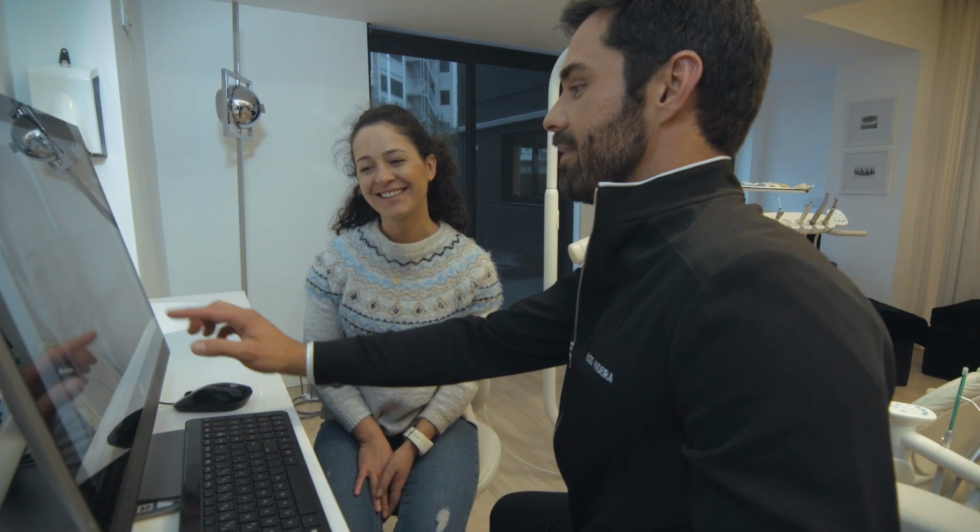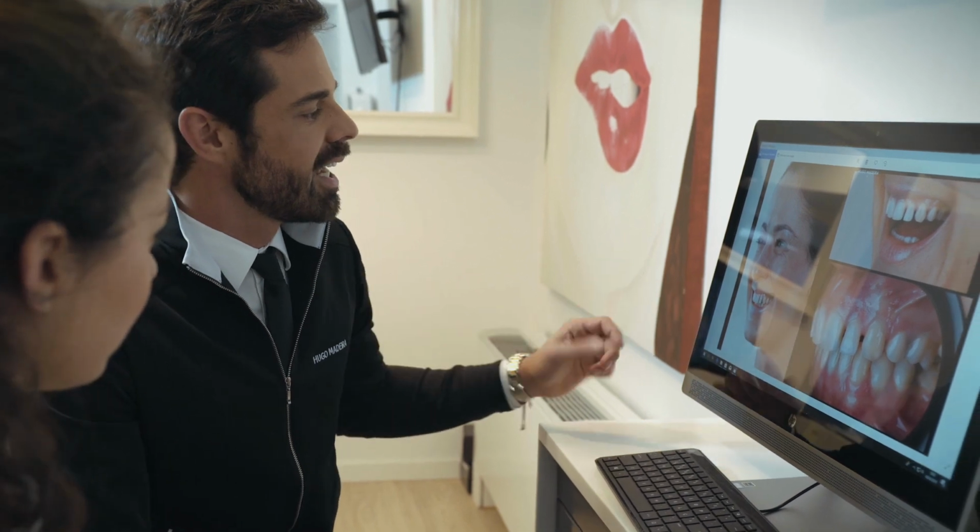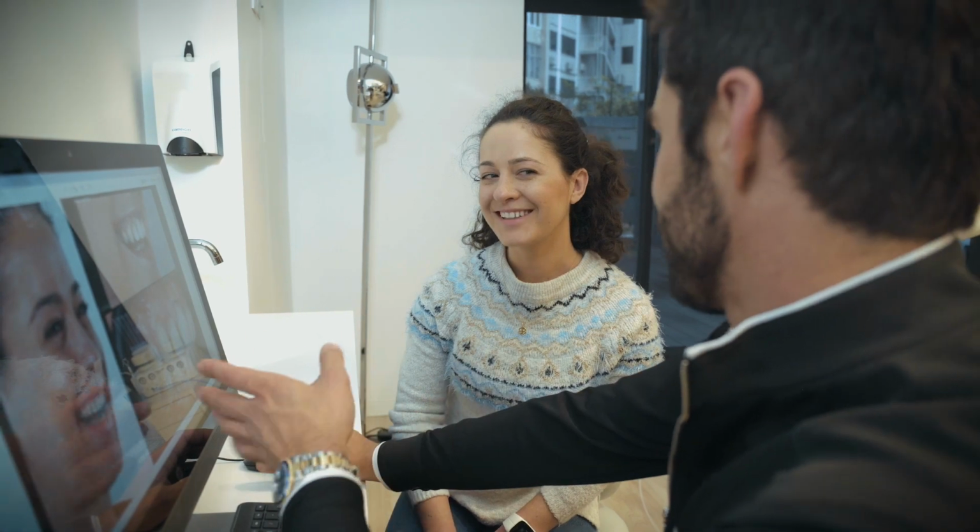Other great thing is the possibility that the patient sees the digital mock-up designed and personalized for them. They can predict the final result and see if it's what they desire before moving on and accept the treatment plan.